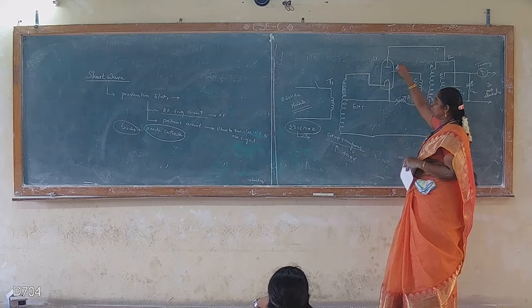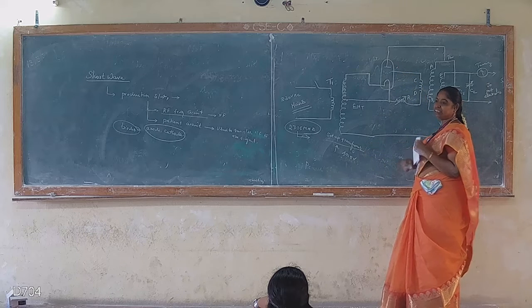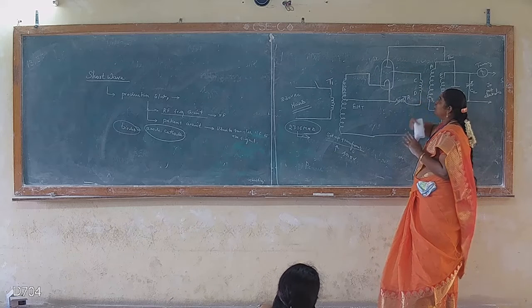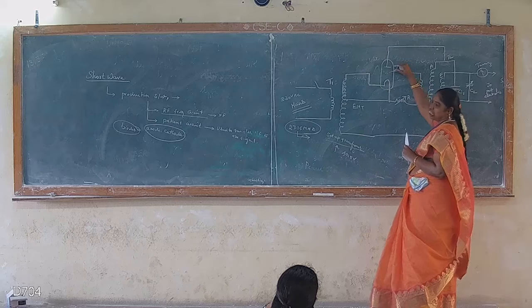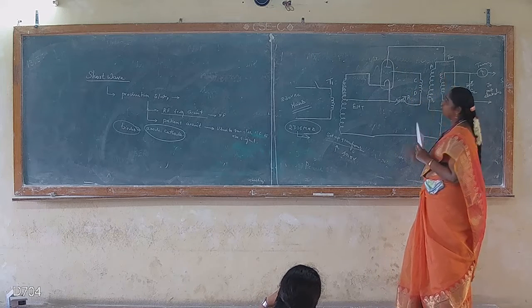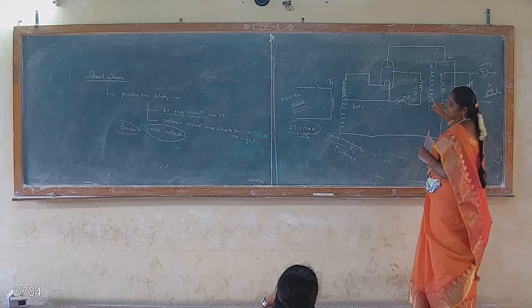For this high amount of voltage, a larger number of electrons can move back and forth. In order to capture this, here also we require a high amount of voltage. So the cathode voltage can be provided by the secondary of the transformer T2, that is with AB.